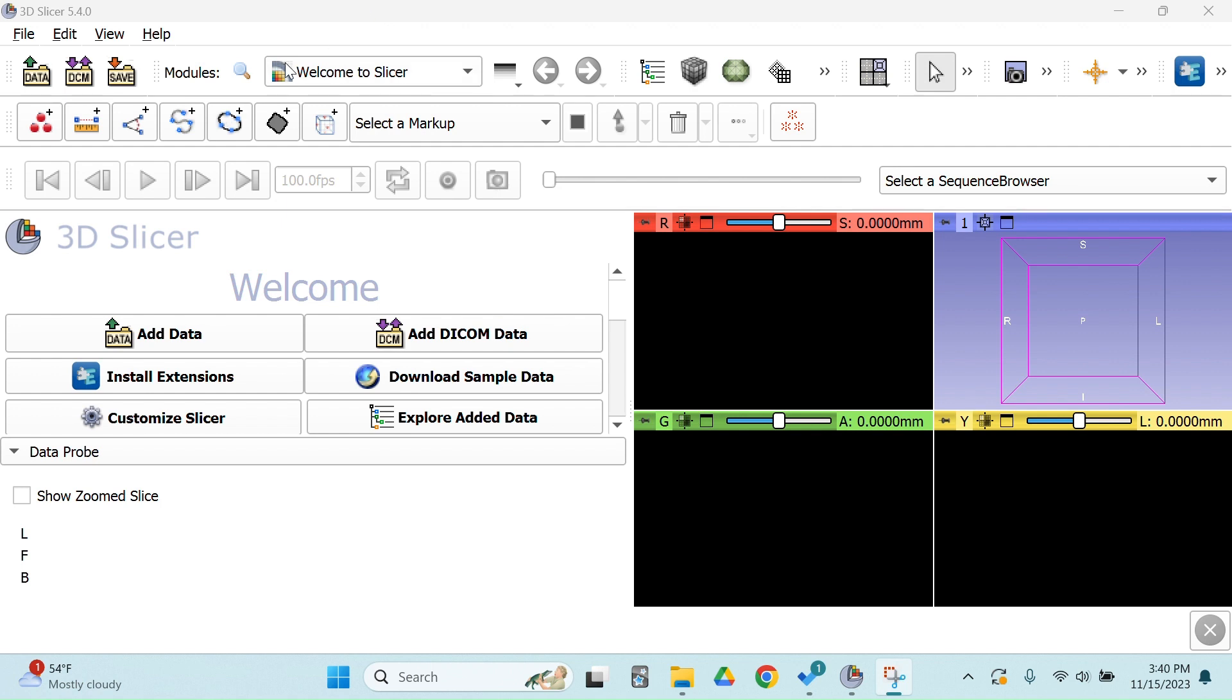So we're going to be using DICOM files today, which are essentially the 3D files that make up CT scans. These were downloaded from the MIDRC database, which is a national database used for medical imaging research, and all the patient information has been de-identified to address any concerns.